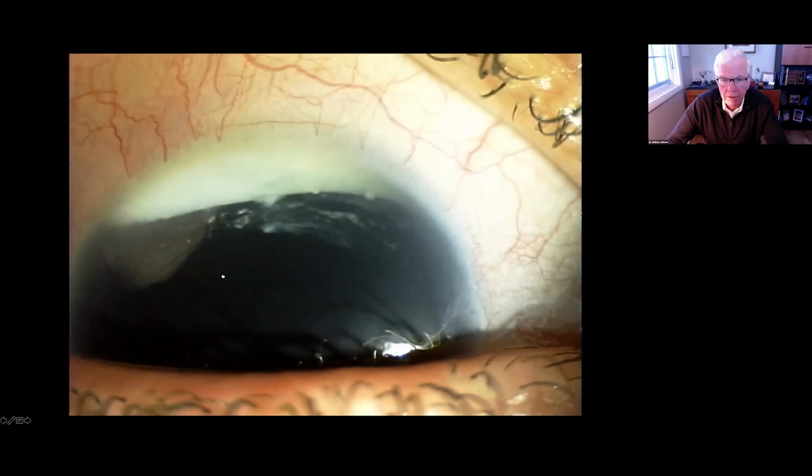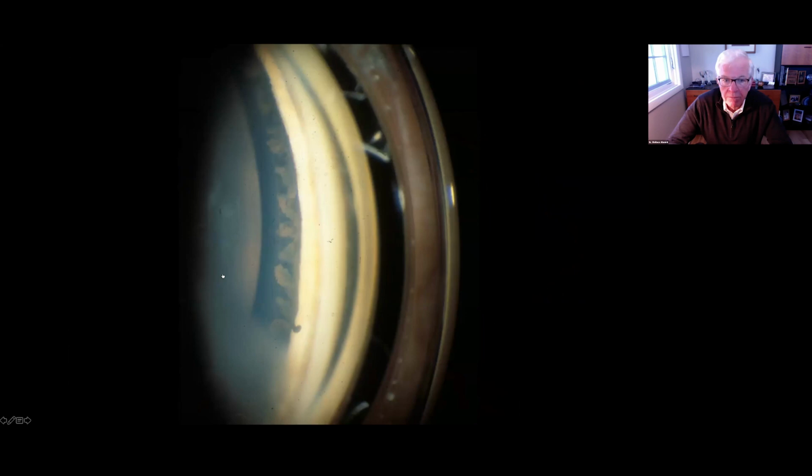This is a great patient. This is a patient with aniridia, again for people who wanted to see the ciliary body. So what you see in aniridia is a stub of iris. This person has a cataract and pannus.